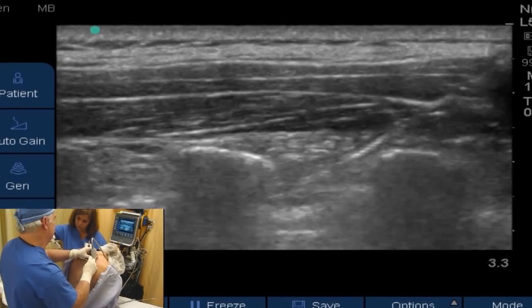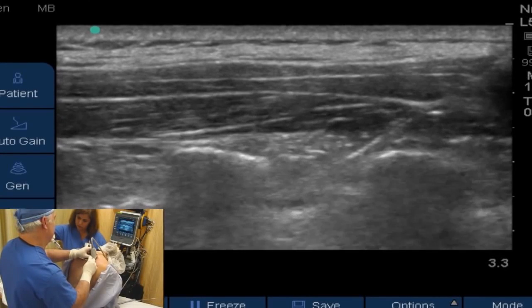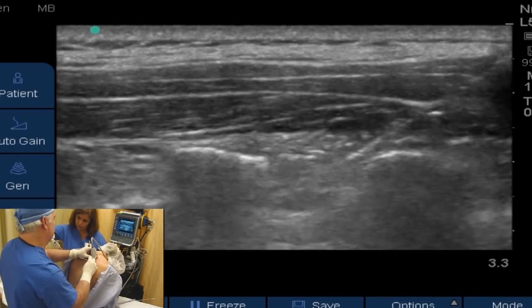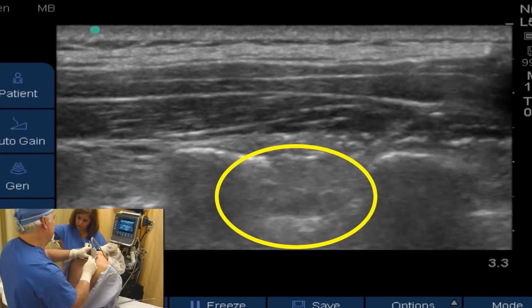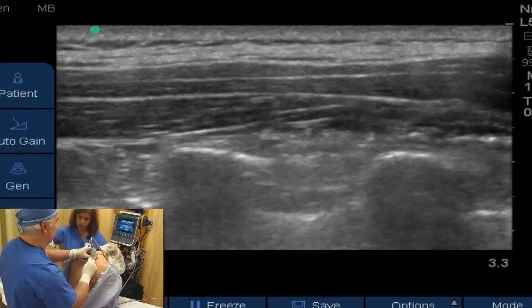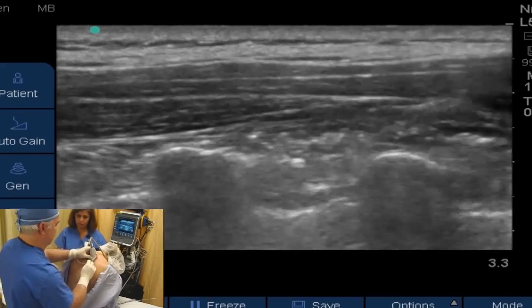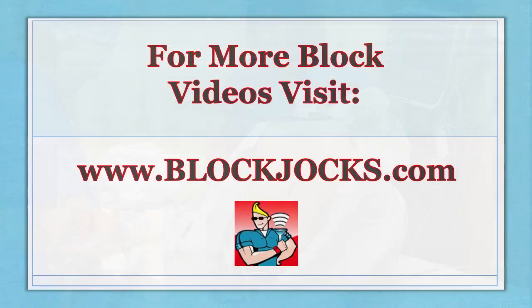As you can see, it's very gentle, very slow movements of the needle. You take your time, you try to advance. You can see the injection there pushing the pleura down, but you take your time to get this needle exactly in the right place. It's a very delicate block and you have to see exactly what you're doing to be able to make this successful without having the complications that can very easily occur.